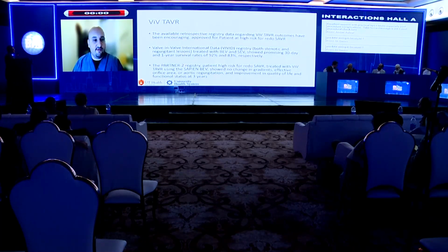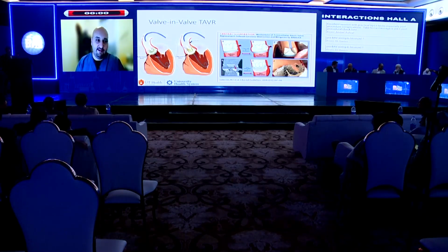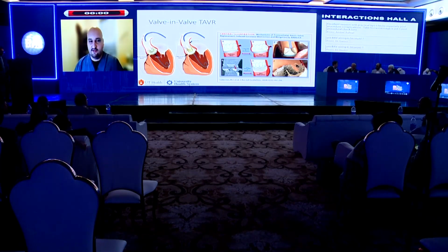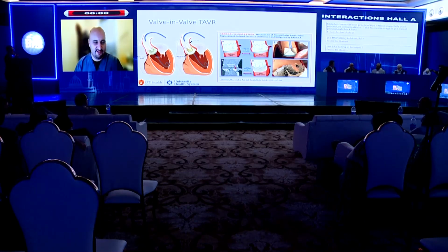Now, there are some issues with this, including suitability of the anatomy and risk of coronary obstruction. There's a lot of work ongoing in terms of leaflet modification and bioprosthetic valve fracture, which is kind of beyond the scope of my talk here with the limited time.